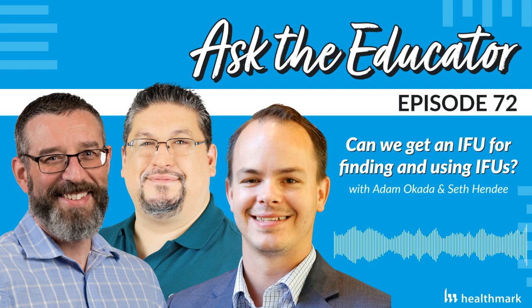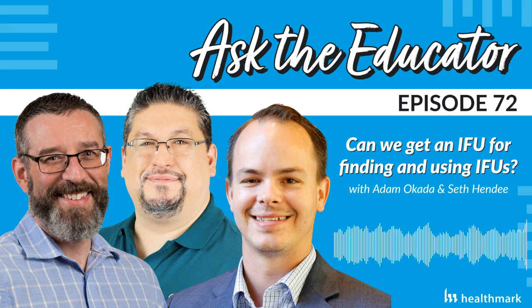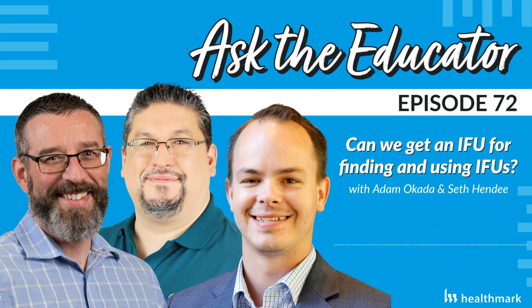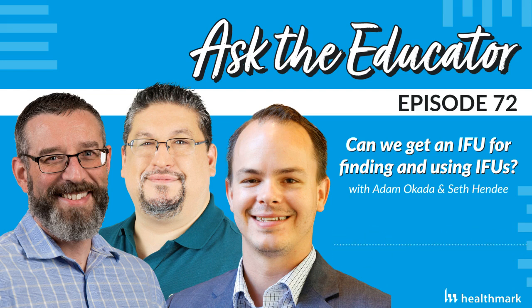Absolutely. I'm going to steal the easy one, Adam. So if he asks you next, I apologize that I'm taking the easy road here. But Kevin just mentioned it a little bit. It's initial training and ongoing competence. Again, we talk about that with processing instruments, and especially our difficult ones, right? I do a yearly in-service on all of my robotic arms, and we do an in-service every year on every flexible scope with Olympus. Why is using this database, why is understanding and reading IFUs any different than a skill that should be taught and then reviewed periodically? And then when your competence is good, there you go.